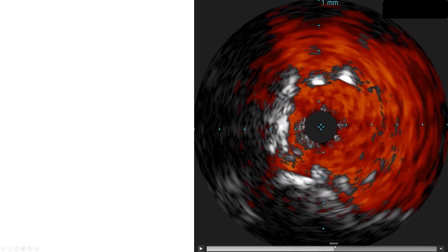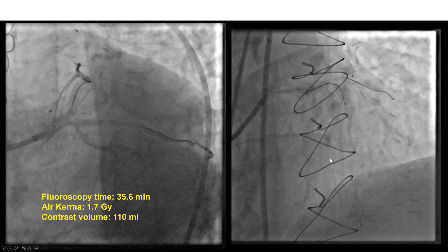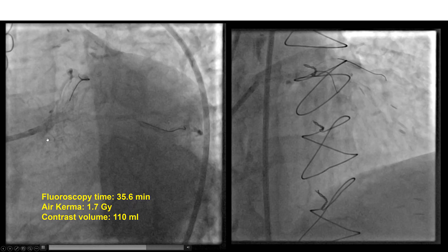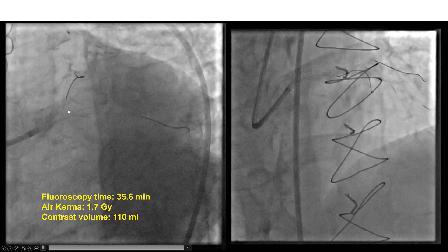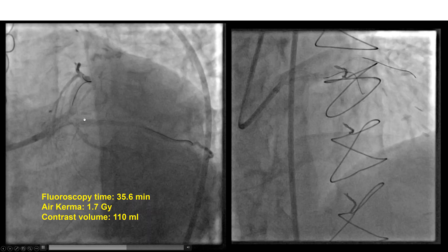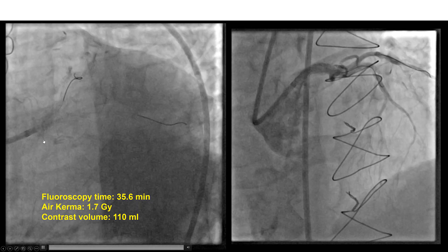We also confirmed that we had covered the left main ostium. This is shown nicely in this image — this is the left main ostium. We can see that the stent is protruding into the aorta, and there is flow around the stent, so clearly we have covered the ostium of the left main. This was the final result, with excellent expansion of the circumflex as well as the LAD. We did not place additional stents in either the circumflex or the LAD — only in the obtuse marginal and the left main.